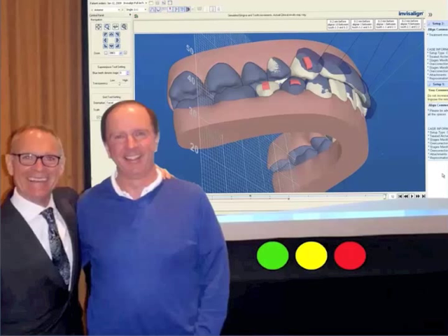The goal of the template is to keep you from overreaching and building in a lack of stability. So if you have a form where you have checked several of the red classifications, the most predictable template will be moving red to yellow. If you have a lot of reds that you're going to try to move all the way to green, it does not mean it's not possible, but it's probably not going to be the first template you get back, because that's going to be more challenging and also less stable, and you're more likely to have relapse. So that's the way the point systems are kind of working on your behalf behind the scenes.